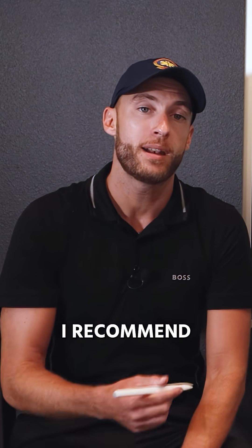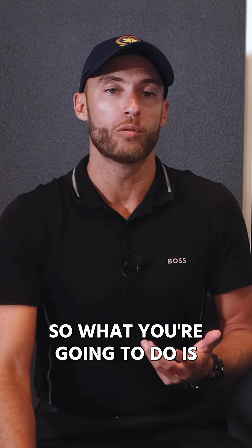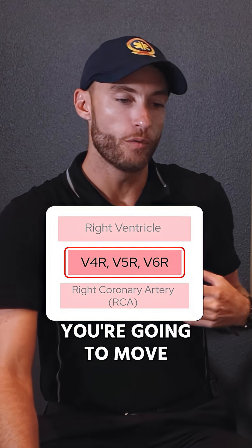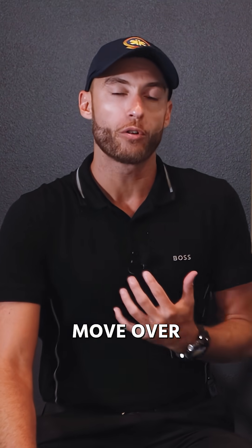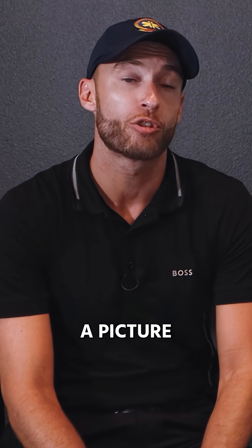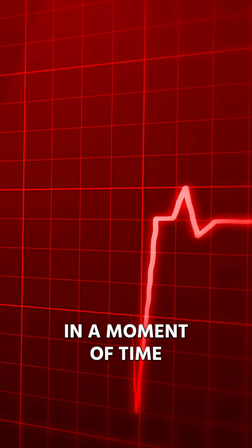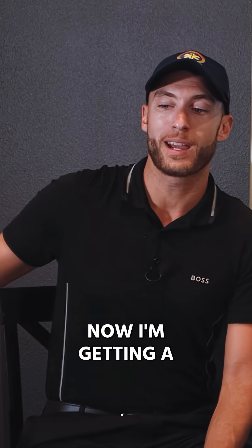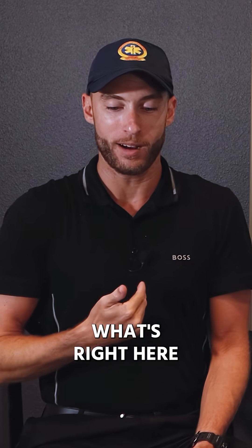Since those leads are contiguous, I recommend moving the leads over — specifically your chest leads. As you can see here, leads 4, 5, and 6 — you're going to move all your chest leads over to the right side. The EKG is just a picture in a moment of time, so if I move the chest leads from the left to the right, now I'm getting a direct picture of the right ventricle.